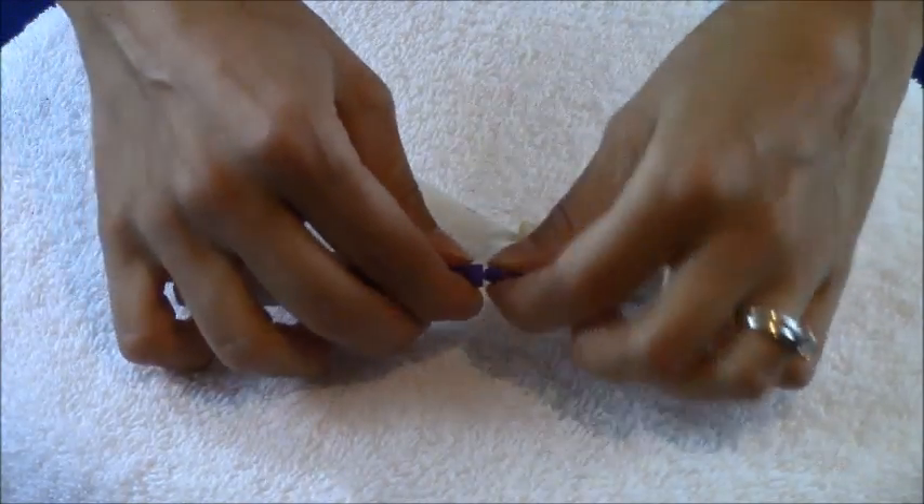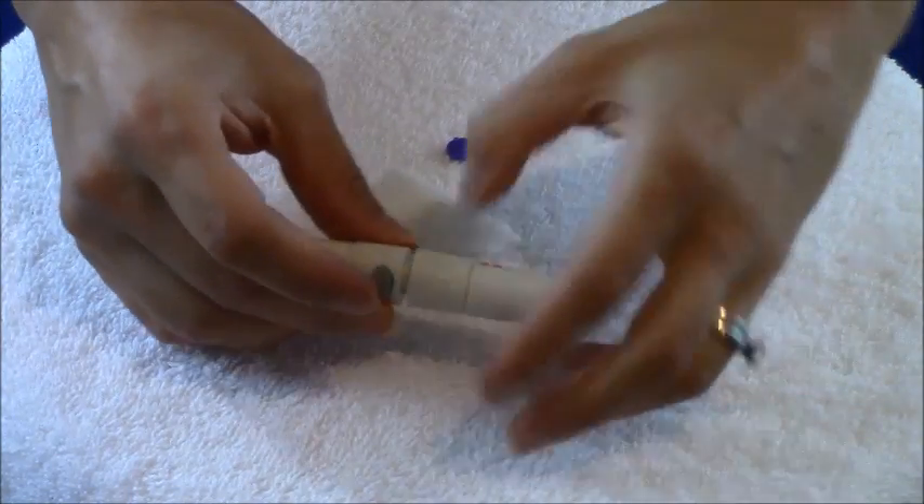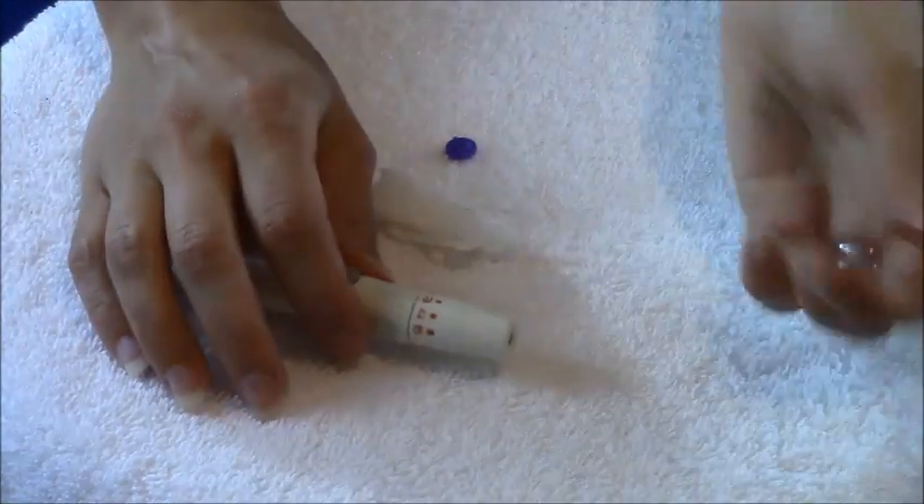Twist this part off, the needle is engaged, then slide our cap in and twist it on. Don't hit this button or you'll fire the needle and have to reset it.